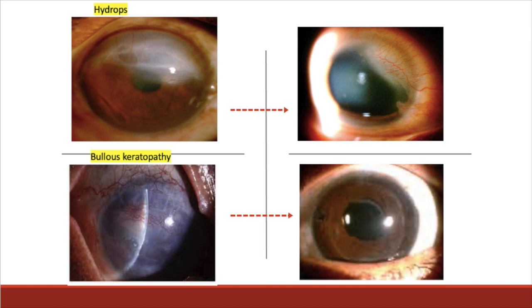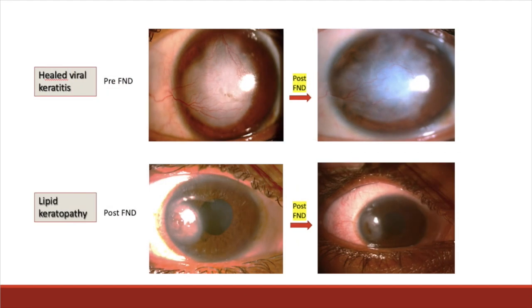LSCD warrants re-establishment of the limbal barrier. Corneal edema resolution itself causes vessels to abate. So, post-infectious keratitis vascularization is the predominant indication for vaso-occlusive treatment like FND. Showing some of the indications where FND has caused remarkable regression of vessels, such as in cases of healed viral keratitis and lipid keratopathy.